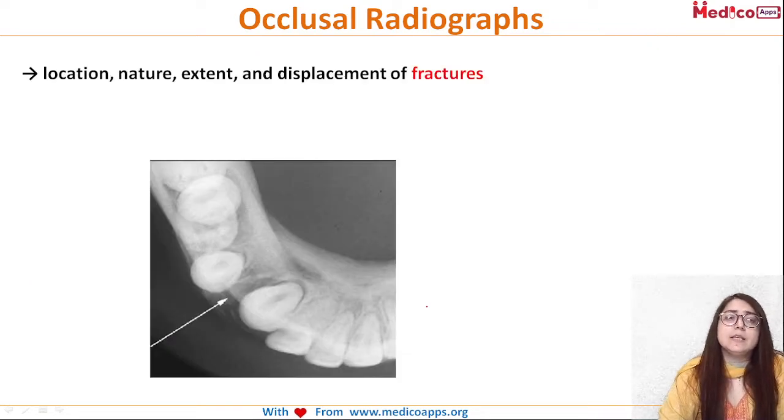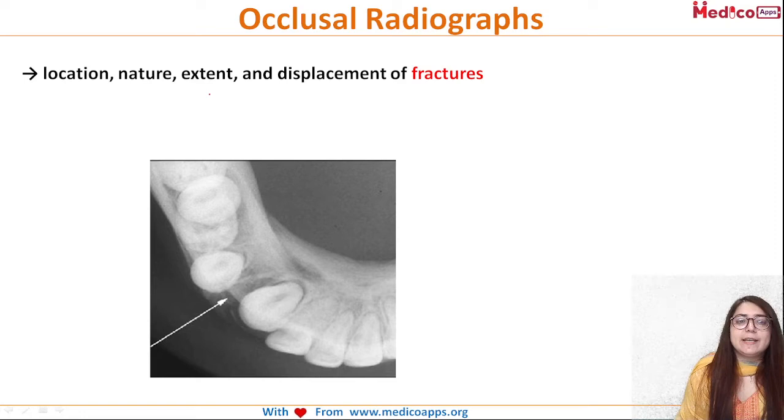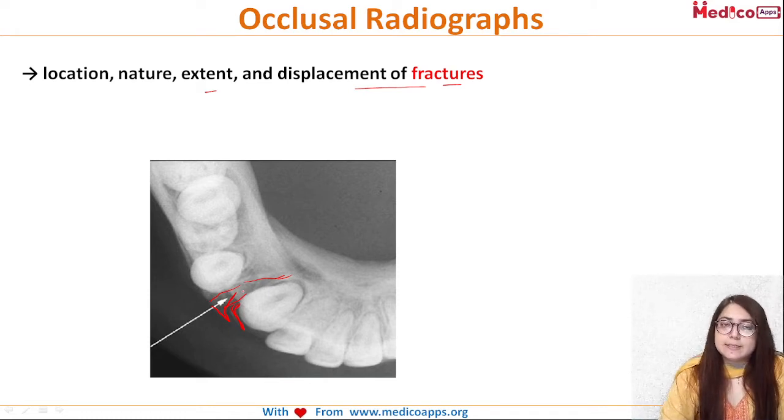Third is location, nature, extent, and displacement of fracture. Now in this mandibular oblique you can see this fracture line. For this you can see there is disruption of this bone. So this is the case of a fracture.